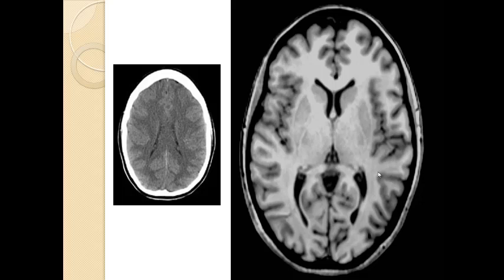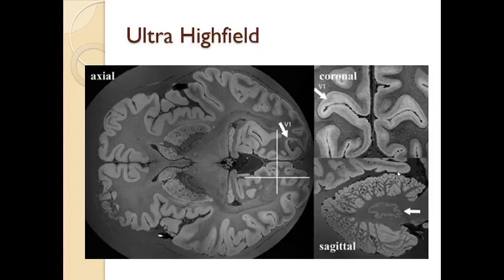So this here is a typical 3 Tesla picture of the brain. Tesla is a strength of the magnetic field. And hopefully you can tell that we have actually a lot more structure and resolution than in either the CT scan or the PET scan. Right? This is the typical research strength MRIs that are out there now, but there are some ultra high field MRIs out there that are taking even more impressive images. So here is some examples of ultra high imaging, and hopefully you can see the innate detail that we are able to pick up, the structures of the brain, just some incredible resolution.